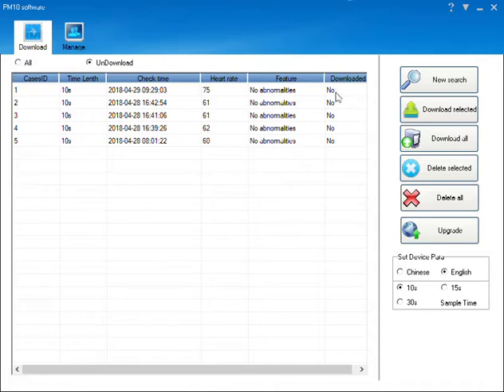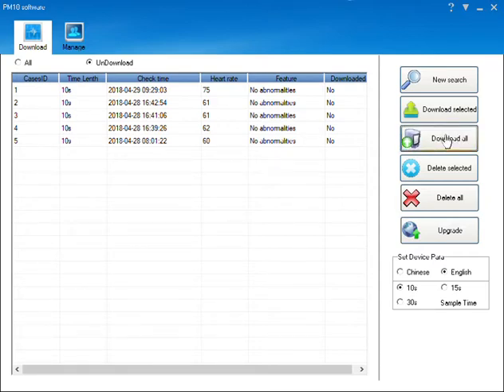After selecting download all, the software will download any recordings onto your personal computer for further review.